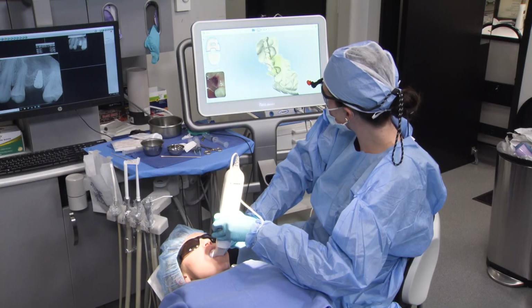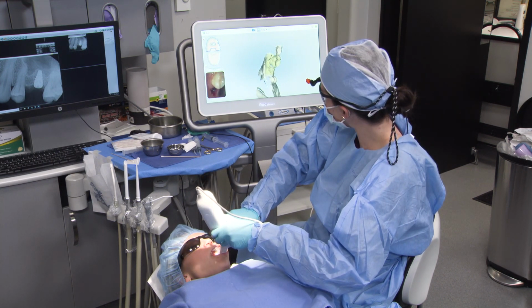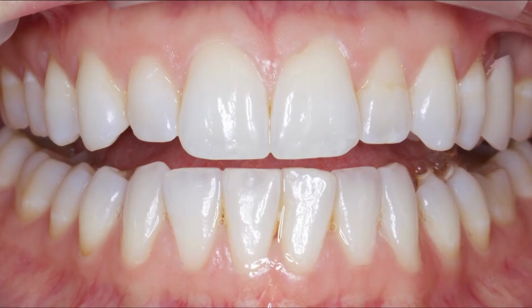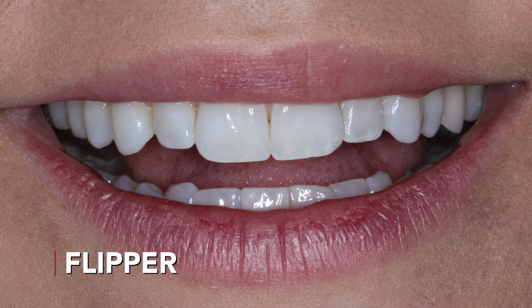Since this is Megan, who loves to smile and talk, we can't leave her without a tooth in her maxillary premolar spot. However, we have to weigh our provisional restoration choices. 1. We could give her a flipper. I don't really like this option as it could potentially put unwanted pressure on our healing site if we do not properly relieve that intaglio surface. Additionally, it could affect Megan's speech, something we cannot really afford to let happen.